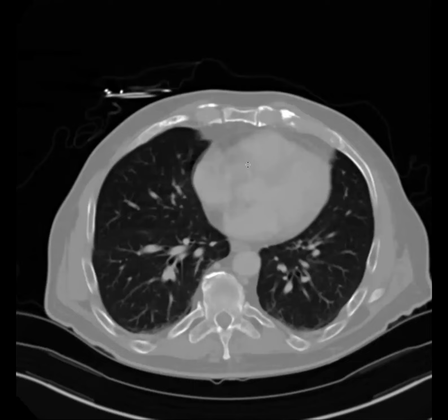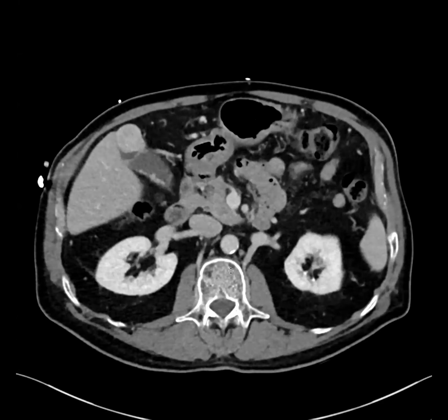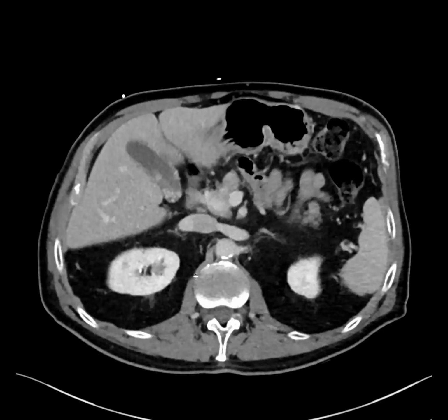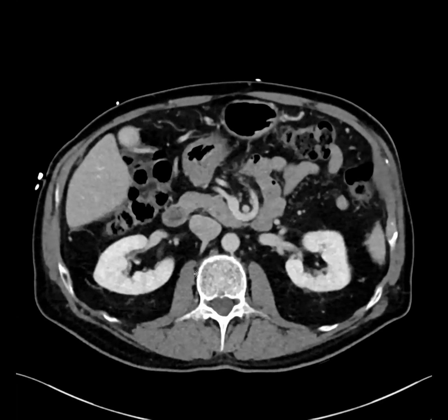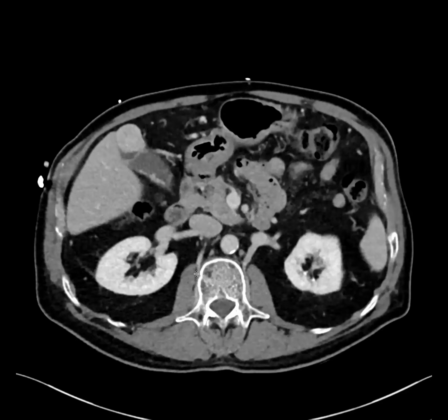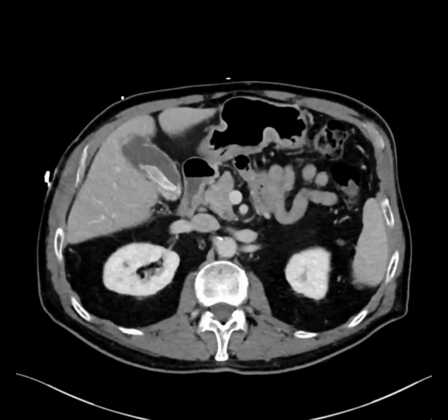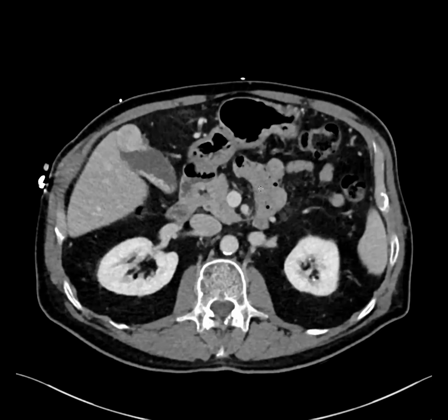Wait, there's something in the gallbladder. Yes, tell me. No priors. Oh, okay. There's some in the ED. This is the weirdest gallbladder I've seen in a long time. So there's a solid enhancing mass of the gallbladder fundus, but there's also this linear thing. I don't know if that's enhancing or just like a cast inside the gallbladder. Maybe it's like a plate-like calculus. Yeah, plate-like stone.